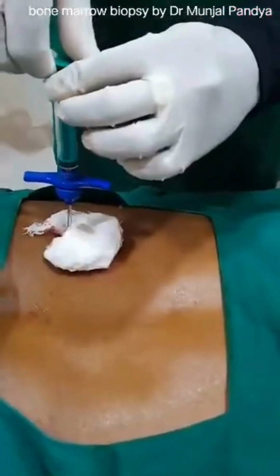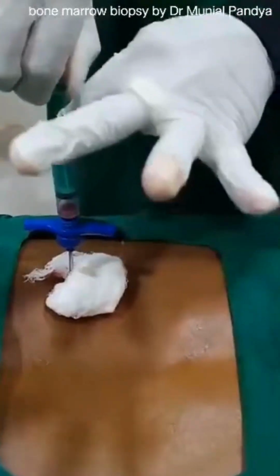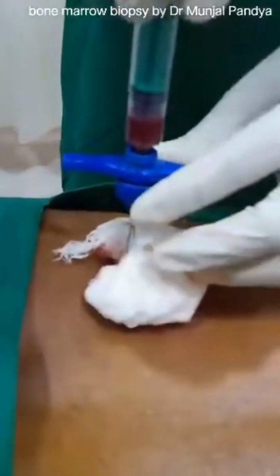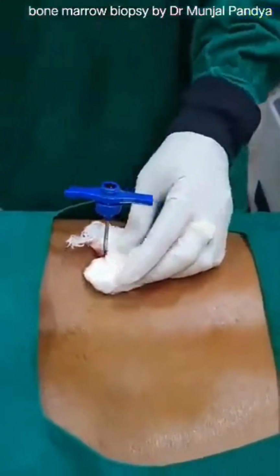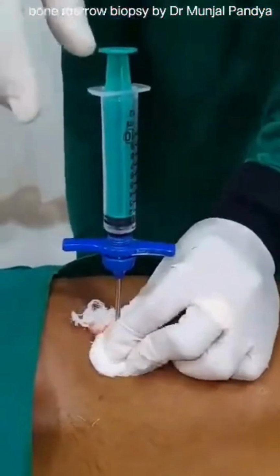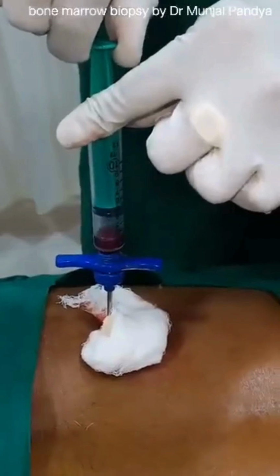Now I am going to suck the bone marrow. You can see the bone marrow here. This is bone marrow. So first we will make a couple of slides for the bone marrow. I am going to give that to the technician, and I will collect even more bone marrow, around 3 ml. We will collect that bone marrow in EDTA and heparin.